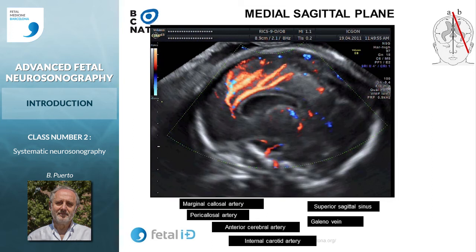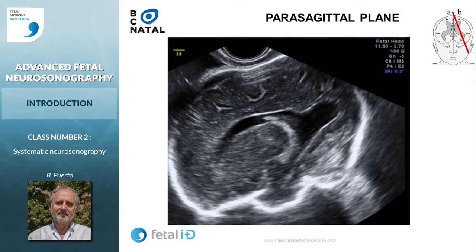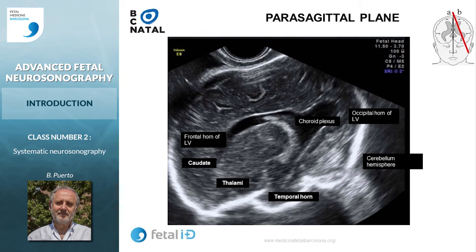In the parasagittal plane, we can see the shape of the lateral ventricles and the characteristics of the periventricular and intraventricular space, and the characteristics of the choroid plexus, especially evaluable by the neonatologist. Also important to us is to see the presence or not of synechiae or periventriculitis derived from infections such as cytomegalovirus.